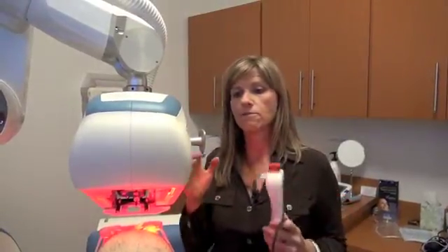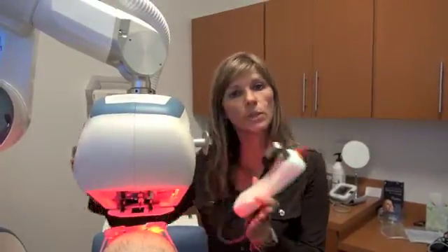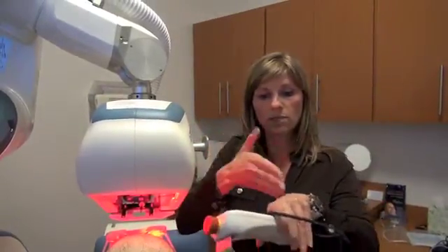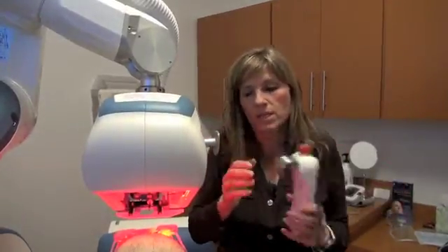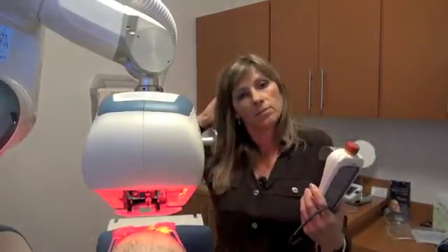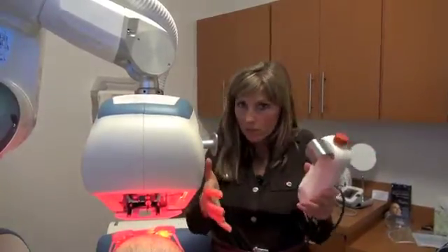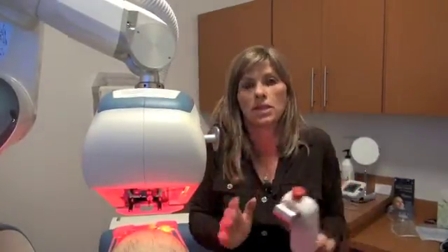Beyond that, there's safety built within the system, and this is called a tool because it performs the procedure. If accidentally someone falls and bumps on a tool during a dissection, that would mean as if someone is cutting something and there's a movement. The system is built to retract the instrument and stop everything for safety. And if the patient accidentally moves their head back into the instruments, the system will stop and retract everything.